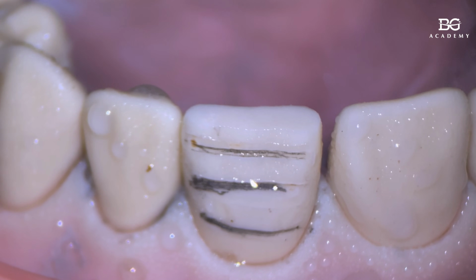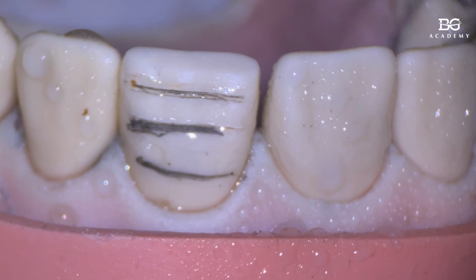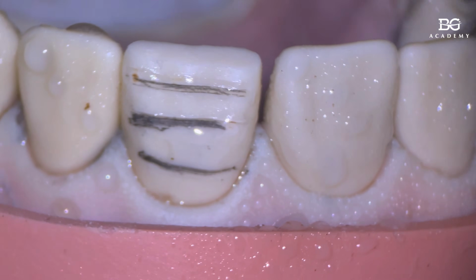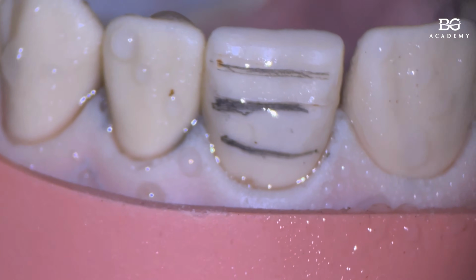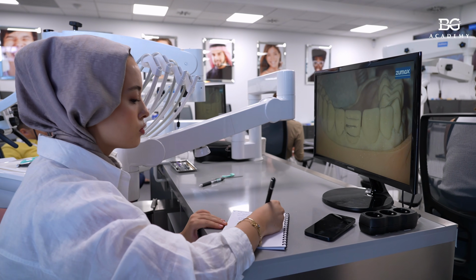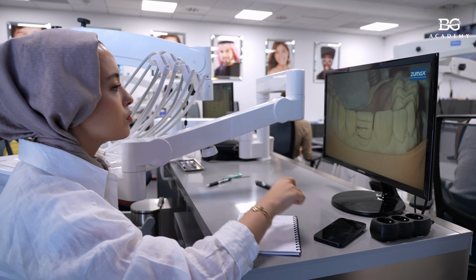Okay, so that's easy. Then, as I told you about planes, we have 3 planes, just to remind you. We have the incisal plane, the middle plane, and the cervical plane. So now we will face the tips on how to control our planes and not do over-reduction. We start with the incisal plane.